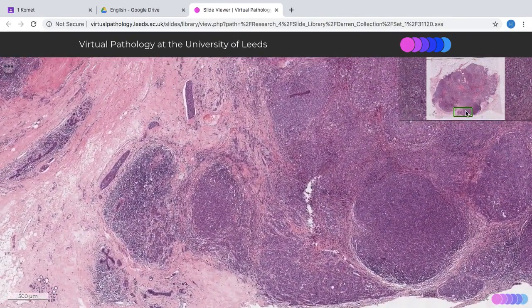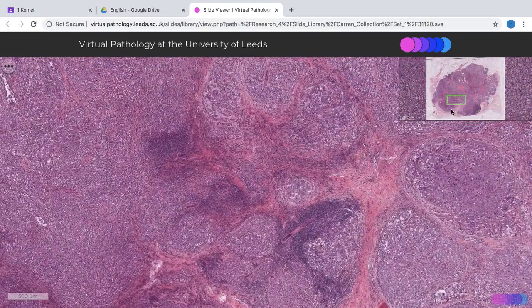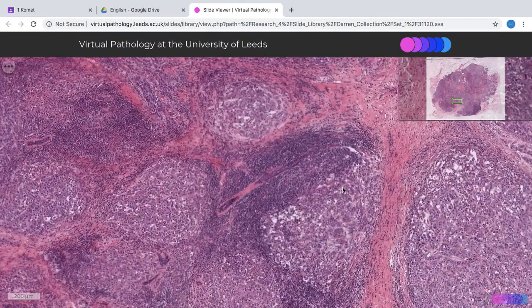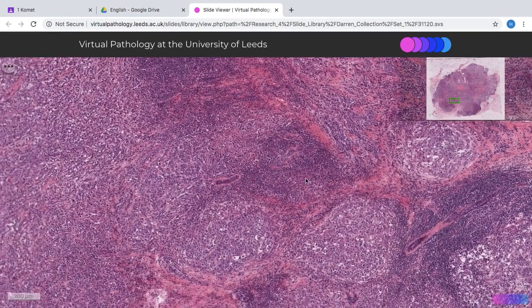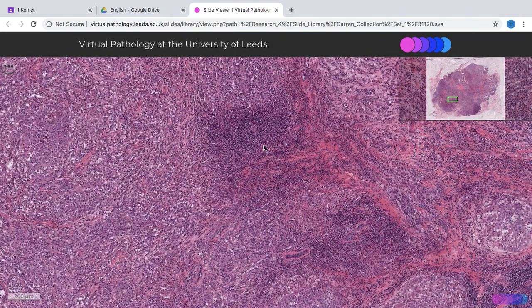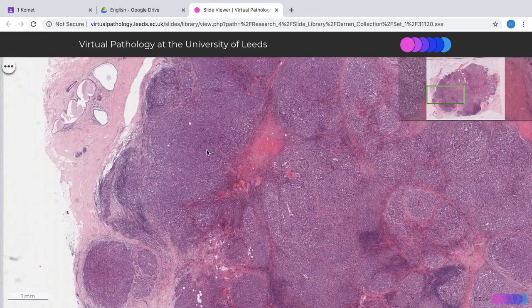On low power, you can appreciate that the tumor looks very, very blue. This is partially because the tumor is quite cellular and, as with a lot of malignant tumors, the tumor cells tend to have very large and hyperchromatic nuclei — that contributes to it being blue. But in this particular tumor, there is also quite a lot of lymphoid infiltrate associated with it, which contributes to the appearance of it being slightly darker than usual.